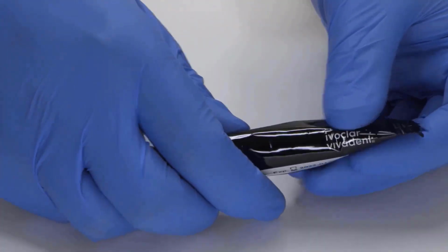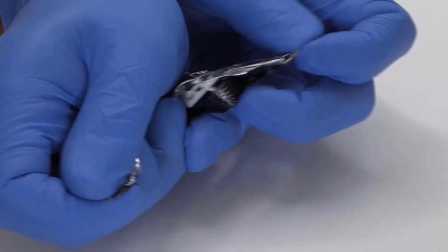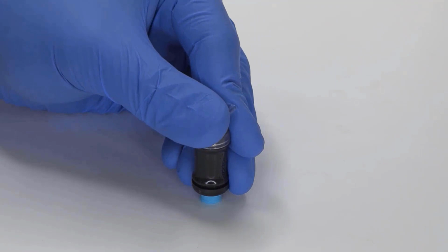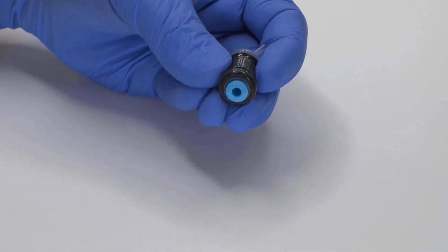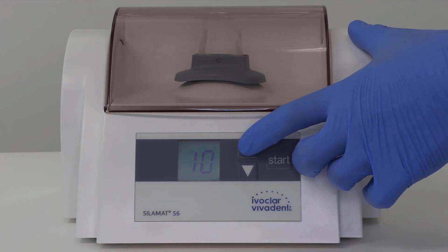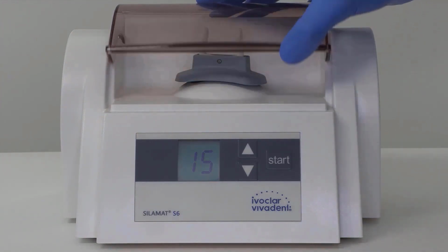To ensure appropriate mixing of the Cention Forte liquid and powder, the light blue plunger needs to be fully pressed in. To successfully do this, push down on the plunger and apply firm pressure on a flat surface as shown here. You should hear an audible clicking sound. And an important advice, do not use a capsule applicator to activate the capsule. Mixing of the liquid and powder requires a capsule mixer such as the Silamat S6. On average, the mixing time required is 15 seconds.